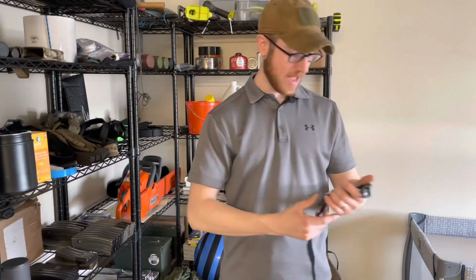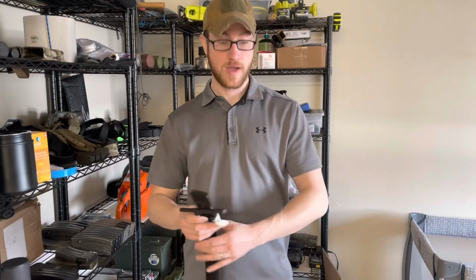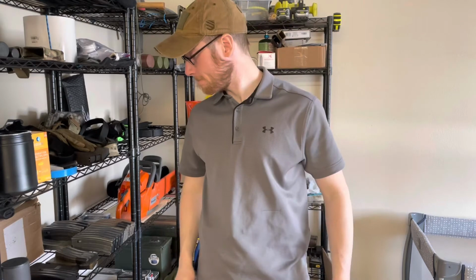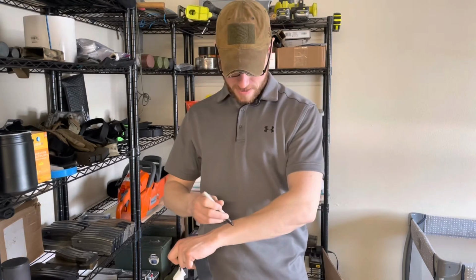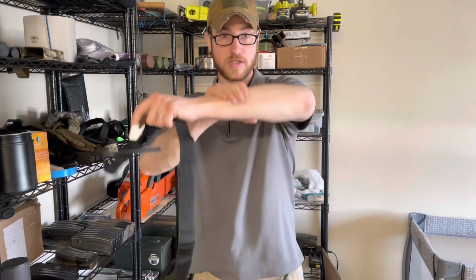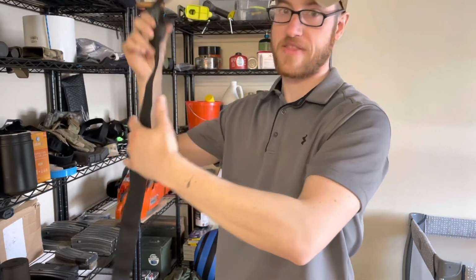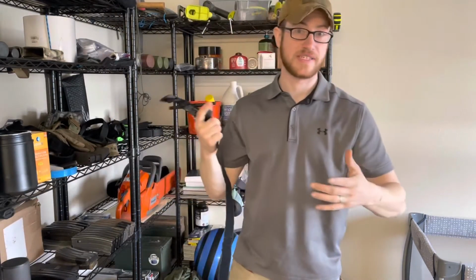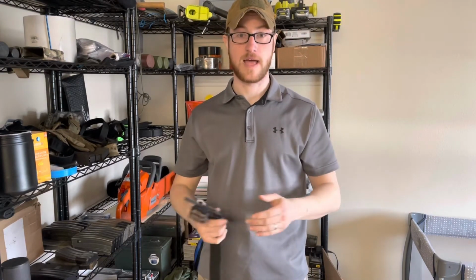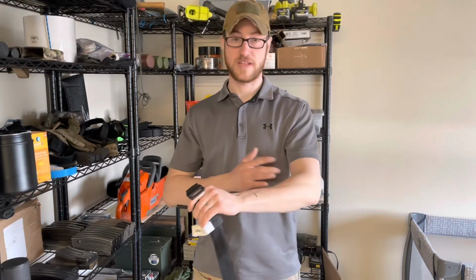But anyway, if you have the time and you're not under fire, place that tourniquet 3 inches above, approximately 1 hand width. So if your injury is here, 1 hand width above, tourniquet here, and send that thing. That's fine if you're not under fire and you can take time to properly assess the situation. If you're uncomfortable with that, high and tight, and just send it that way. It really doesn't matter if there's no reason to not assess and put the tourniquet where it needs to be.